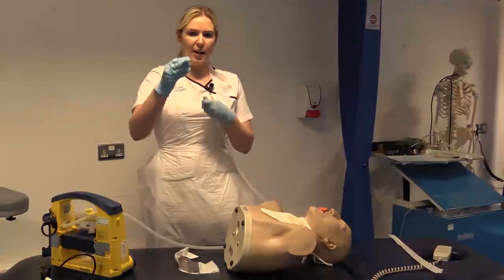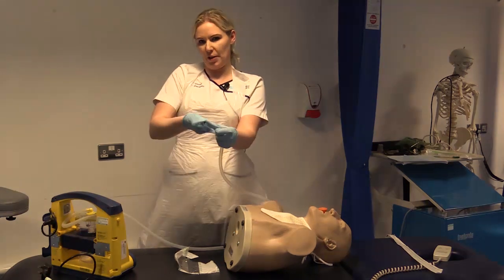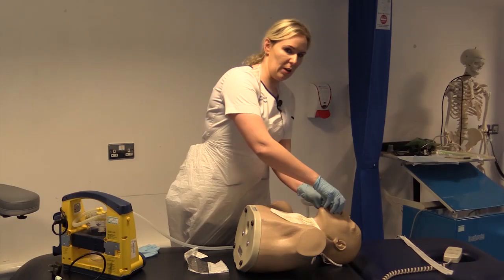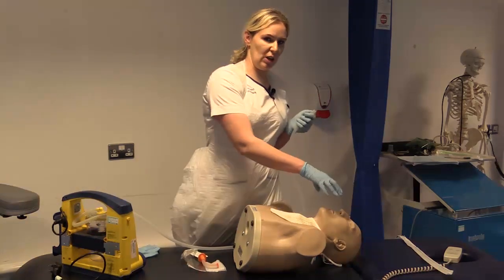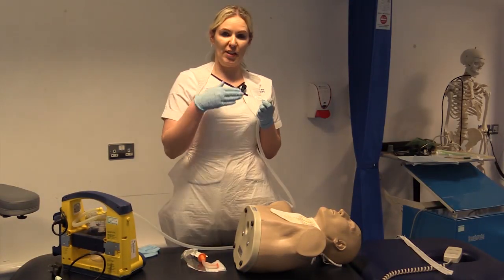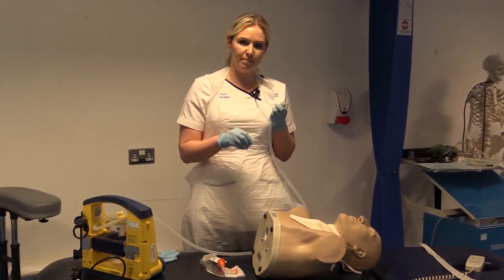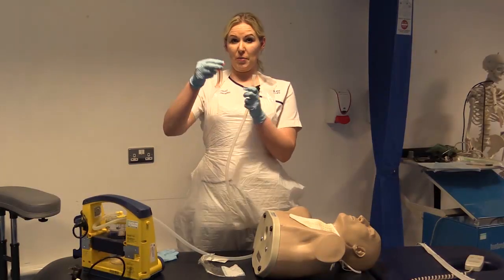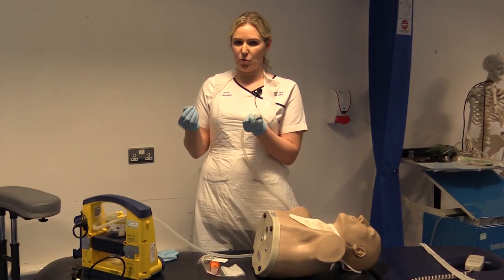You're going to wrap your catheter around your dominant hand, pull the lower end of your glove over the top of your catheter, and discard that in the appropriate bin. You're going to remove your airway. You're going to reattach your oxygen, and then reassess your patient and decide whether you need to repeat your suction again. If not, you're going to check their clinical obs are returning to normal. You're going to flush out your suction tubing. You're going to wash out your airway with cold water so that you can use it again. And you're going to remove your PPE and wash your hands.